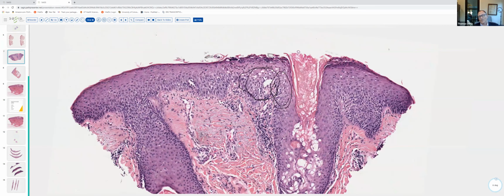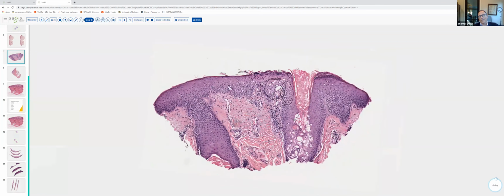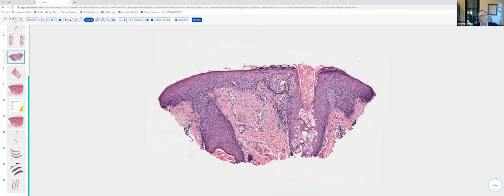The characteristic features that we see that are defining for seborrheic dermatitis, in addition to the spongiosis, are the presence of mounds of purulent scale crust located at the lips of this follicular ostium. And this constellation of findings is very characteristic and suggestive of seborrheic dermatitis. In this case, if there was any clinical data that indicated that the presentation was somewhat atypical, one would want to do a PAS, of course, to rule out tinea faciei.